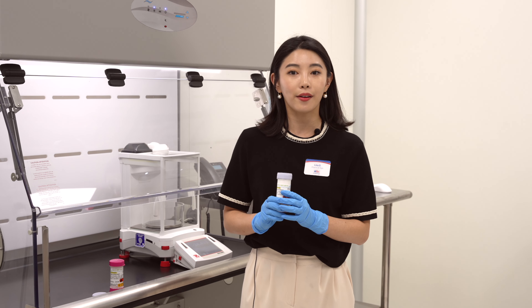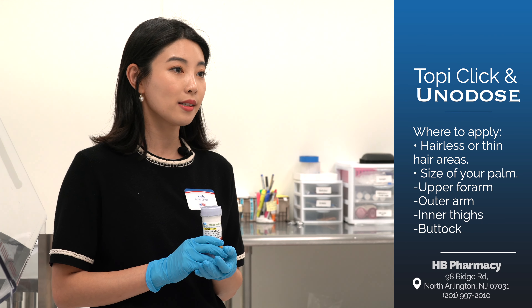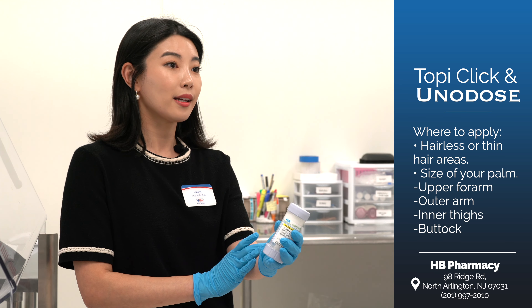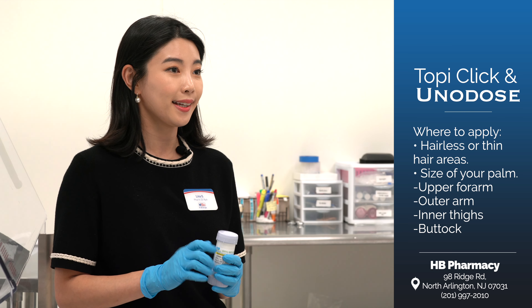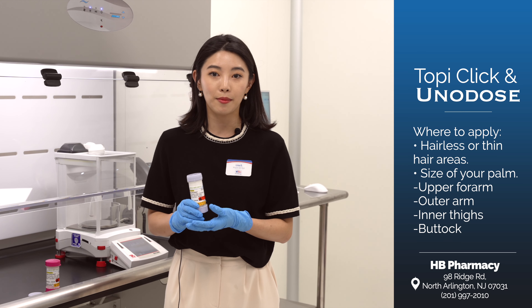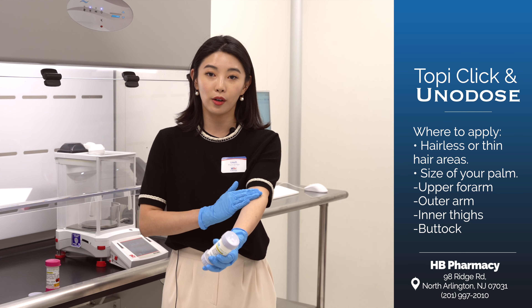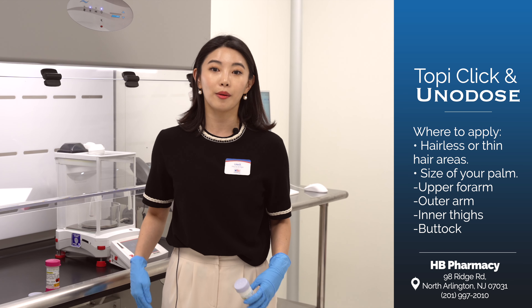You have to select the area where you're going to be applying the cream. We recommend that you apply it to a hairless area — areas with thin hair could also work. The area should be at least the size of your palm or think of a dessert plate. Those areas would typically be your upper forearm, your outer arm, your inner thighs, or your buttocks.